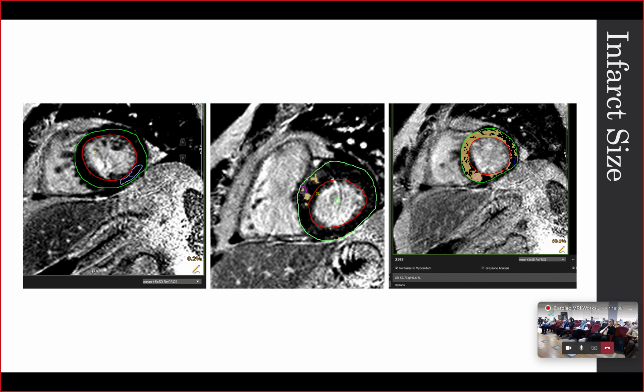Now in the software, you include the endocontour and the epicontour, and then you adjust a reference of normal myocardium. And here at the bottom, I'm not sure, could you see my cursor? This has to be adjusted to the mean plus 5 standard deviations of the reference, so that the software will pick all areas of enhancement as the infarction size. As you may see in this example, the late enhancement is 52 grams, which is around 40% of the myocardium.